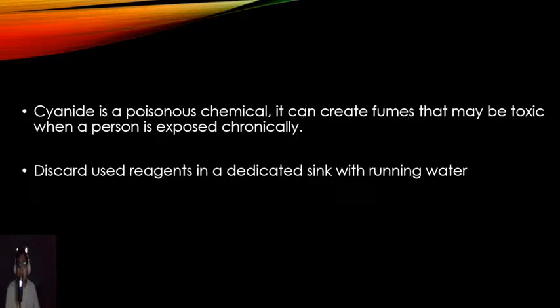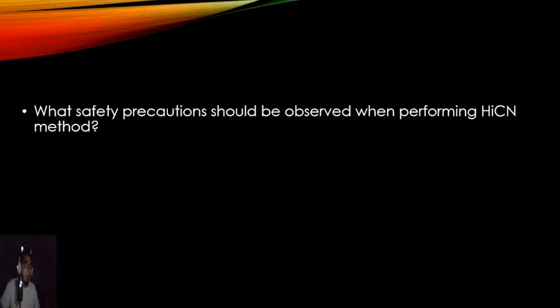A lot of the automated analyzers right now still use hemoglobin analysis. So, for example, as I mentioned before, Adrian and Joanna would make the reagent 30 minutes a day for 2 years, and then at some point they felt chronically ill from cyanide poisoning. So you need to discard the reagents, of course, in a dedicated chemical sink with running water.